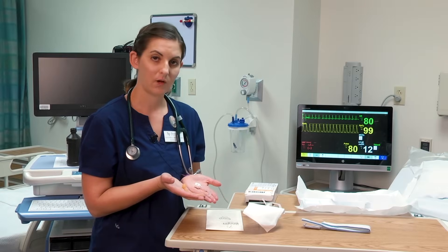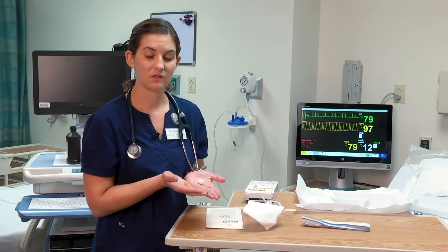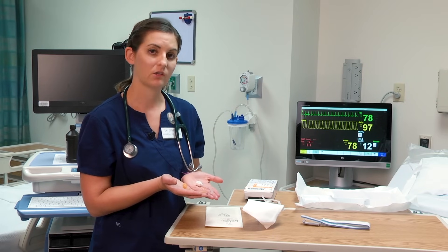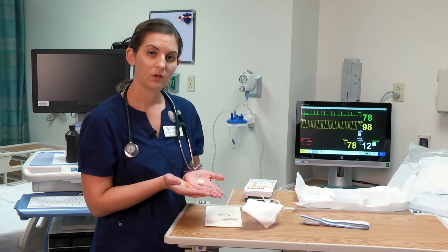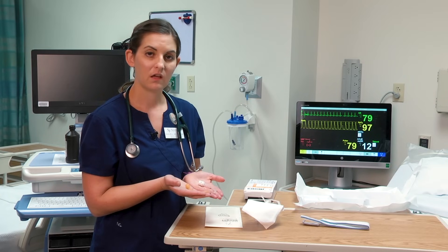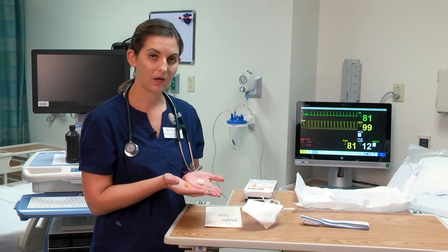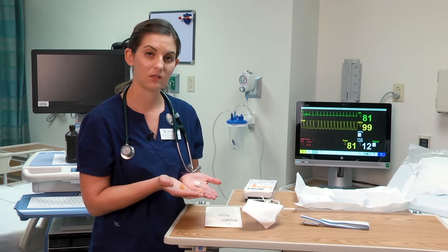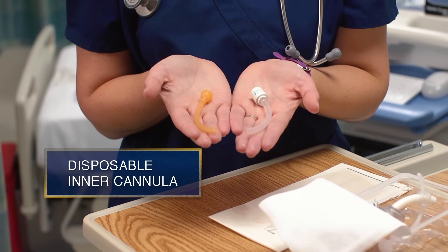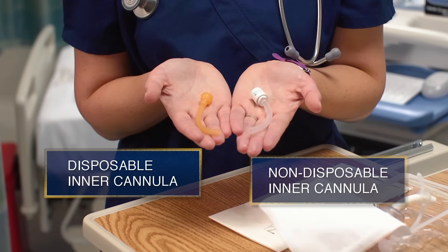The only time you need to remove and clean the inner cannula is for someone with a non-disposable inner cannula. If the patient has a disposable inner cannula, all you do is remove the old one, replace it with a clean, new, sterile inner cannula, and then clean around the faceplate and replace the gauze dressing. You do not need to use hydrogen peroxide — you just insert a new one. In my right hand is a disposable inner cannula, and in my left is the non-disposable inner cannula.